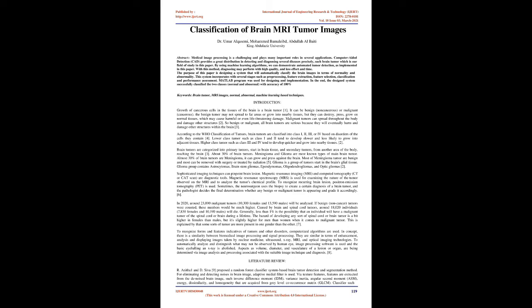MATLAB program was used for designing and implementation. In the end, the designed system successfully classified the two classes, normal and abnormal, with accuracy of 100%. Keywords: brain tumor, MRI images, normal, abnormal, machine learning-based techniques.